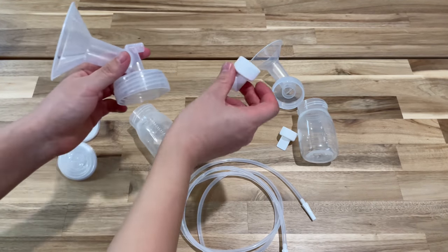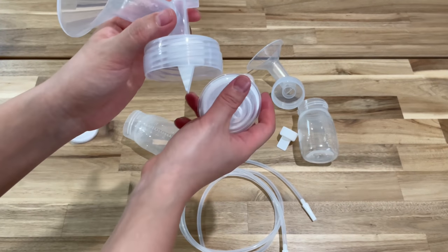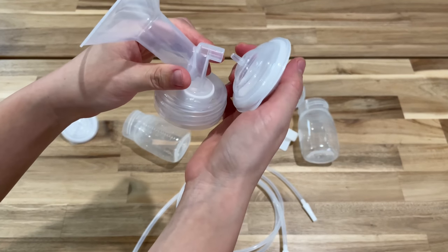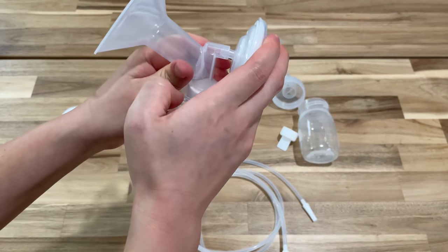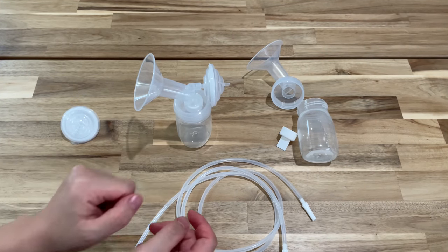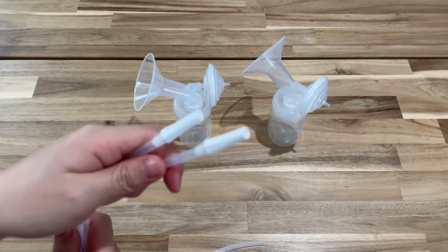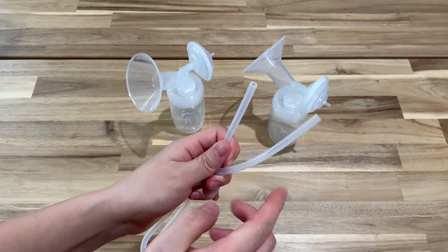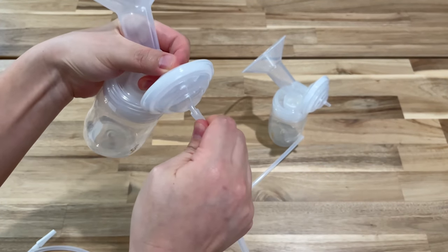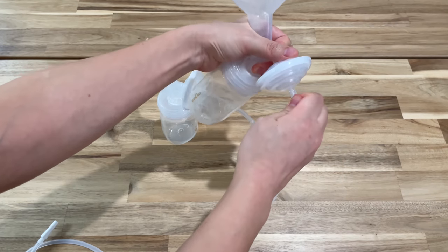Once you've selected the right flange size, here's the setup. Grab the flange and insert the valve into it. Then add on the backflow protector — the thicker end goes in; if it's very loose, you have the wrong end, so flip it. After that, add the bottle on the bottom. Set up the other one the same way. Then add the tubing — the end that goes into the pump has special connectors, and the plain ends go into the backflow protector. Just wiggle them all the way in.